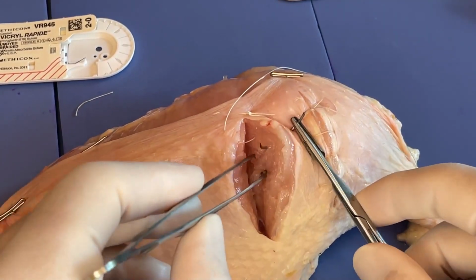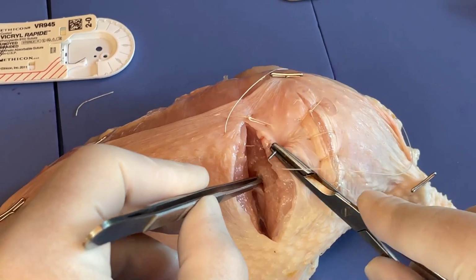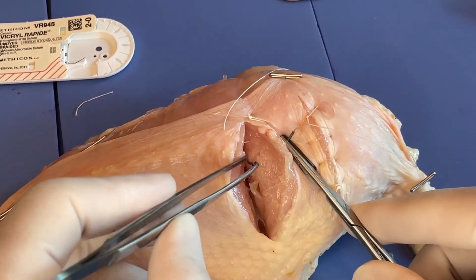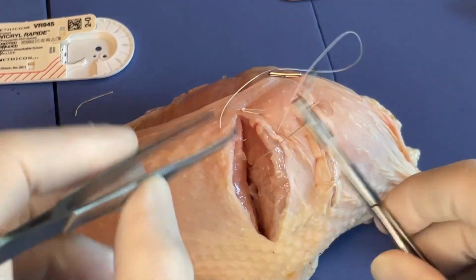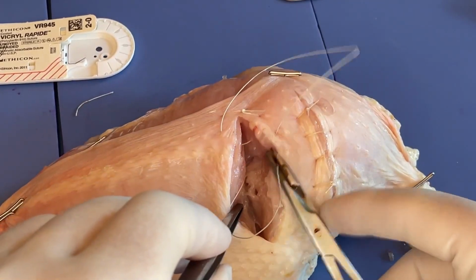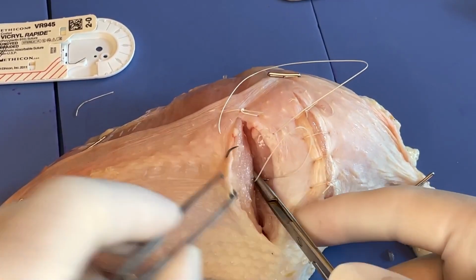This is a little bit of a smaller needle than I would typically use for a deeper wound like this, but let's back this out, take a little bit of a bigger bite there. Now I've gotten down really to the bottom of that defect. And then with this next bite again, I want to get all the way down to the bottom of where that defect started, and then curve my way up there.